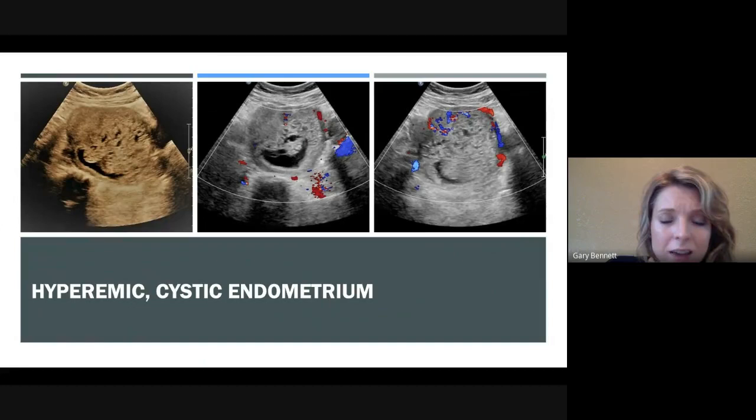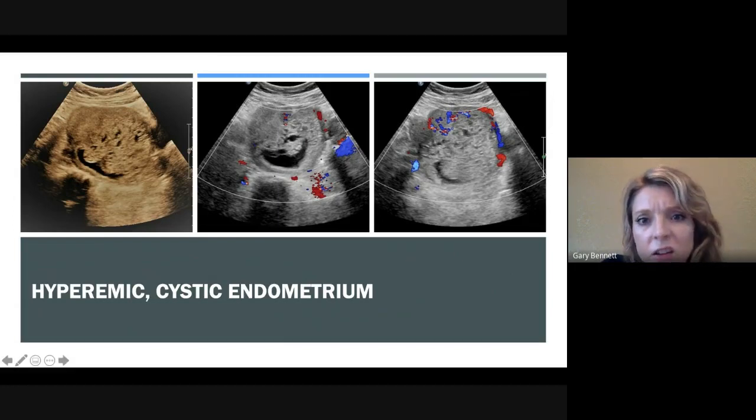I have only had a couple hydatidiform moles, and I think mine lit up even more than this. This is a little bit older of a machine, it looks like. But you can even see just on this near field, you can see a lot of vascularity in here. It can fill up even further if you have a slightly more powerful machine.